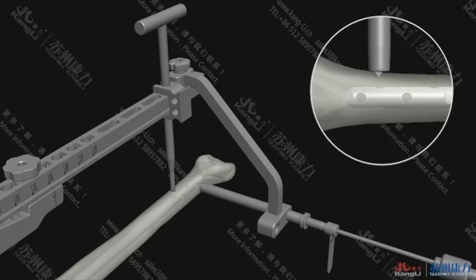When a small pit shows up on the bone cortex, drill with the 4.0 drill bit. When the first layer of bone cortex has been drilled through and the 4.0 drill bit reaches the inner wall of the contralateral medullary cavity, adjust the distance between the ball spike on the 4.0 drill bit and the 4.0 inner sleeve to about 0.8 cm using an SL wrench to protect the soft tissue of the contralateral skin. Then continue drilling until the contralateral bone cortex is drilled through.